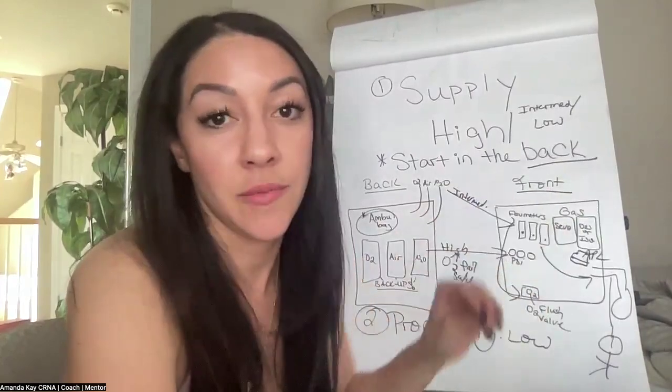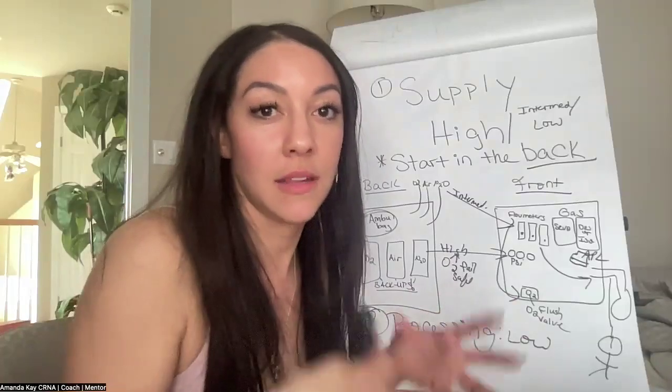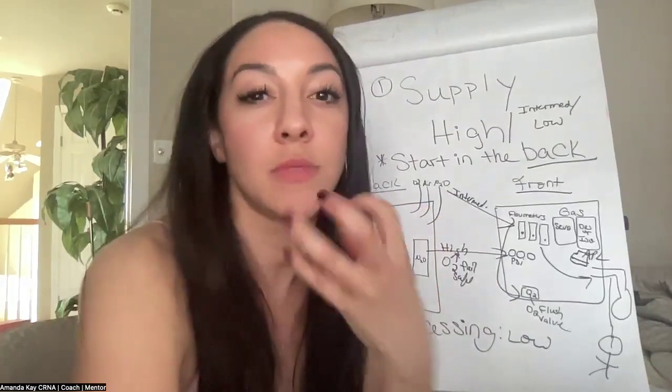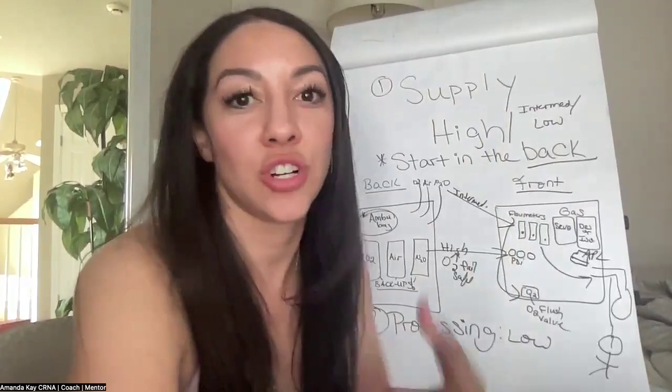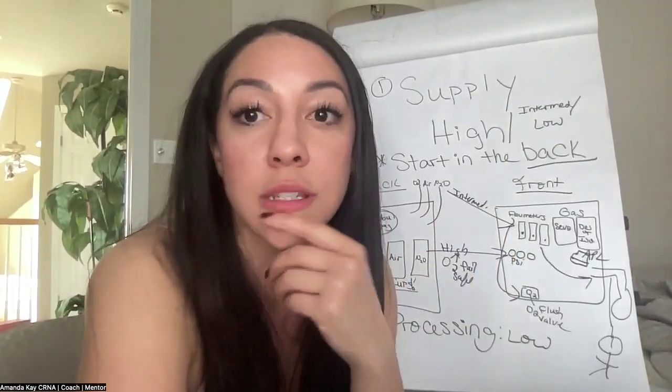You can also use it to recruit alveoli. You can turn it to anywhere from 40 to 50, squeeze that bag for a little bit, and then release it. That gives recruitment of alveoli. Sometimes, especially if they're doing neck surgery, they want to see what happens if you add high pressure. Do they have any bleeding? Okay, so that's also part of your low pressure system.